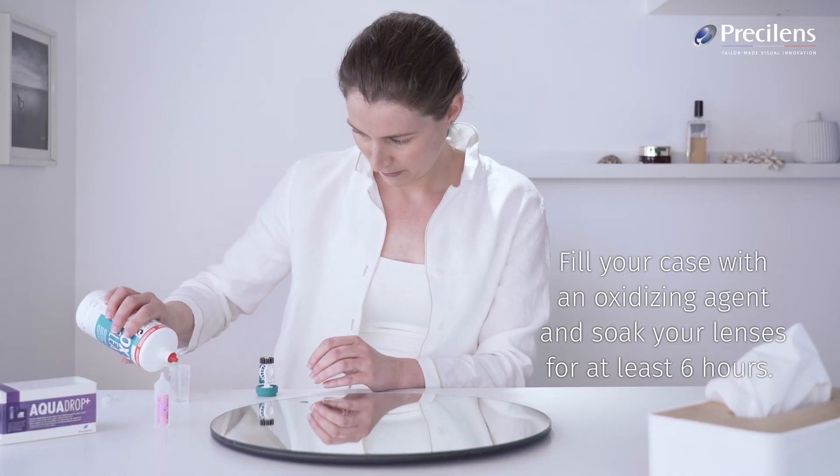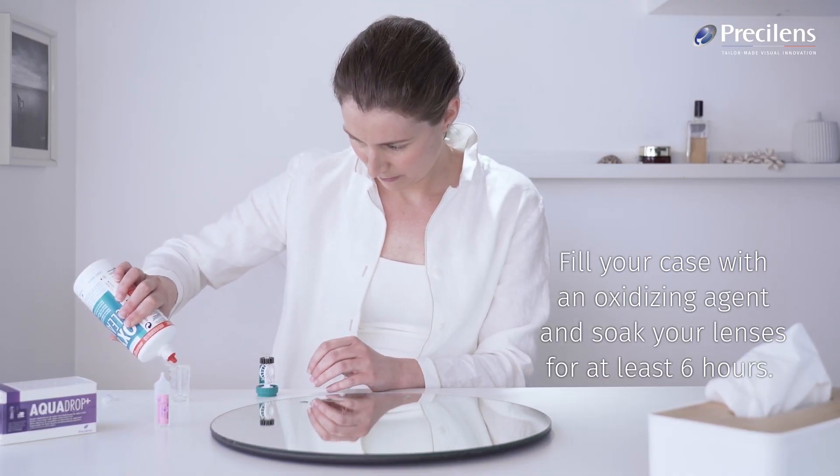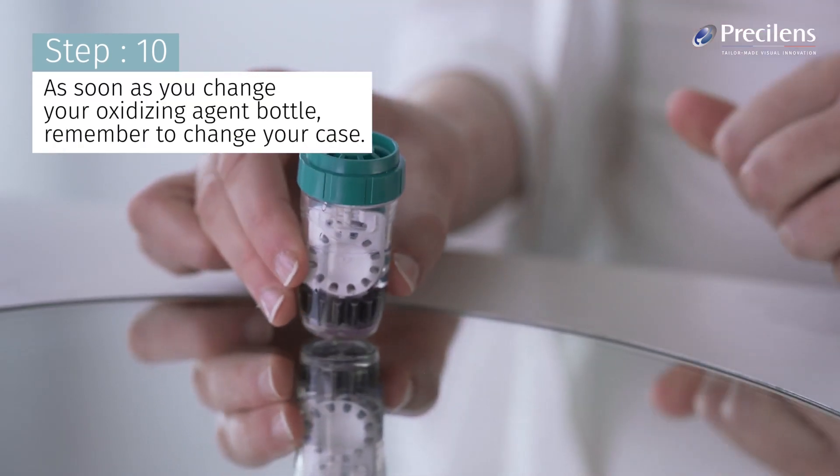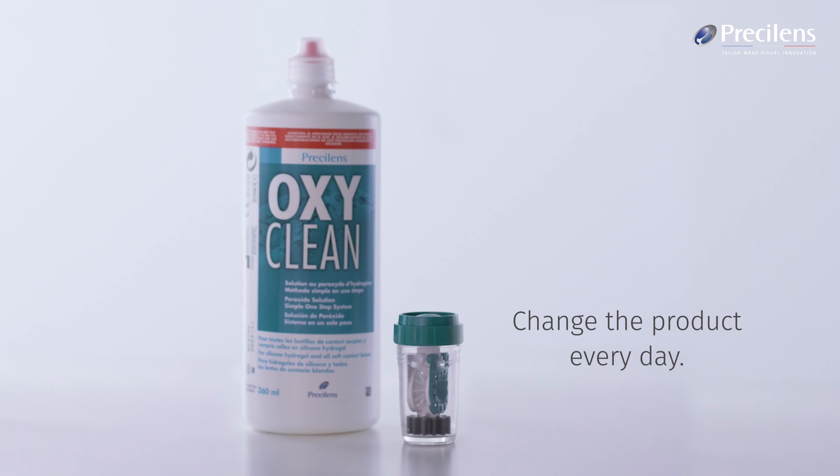Fill your case with an oxidizing agent and soak your lenses for at least 6 hours. As soon as you change your oxidizing agent bottle, remember to change your case. Change the product every day.